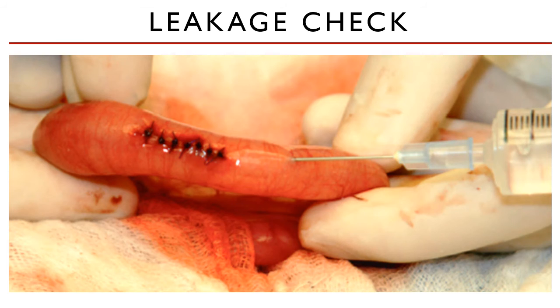Carefully push the fluid into the intestinal lumen directed to the incision site and check if any fluid will leak out. Quite honestly, if you put so much pressure, even a good apposition on the wound would show leaking because you put so much pressure in it. So take care to simply simulate the pressure that the intestine undergoes when ingesta is flowing through it. If you don't see any leakage, then you're good to go.